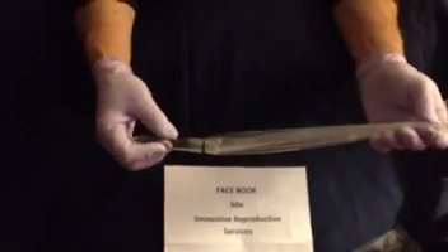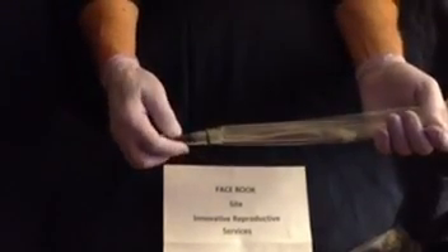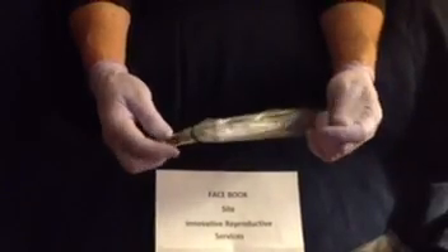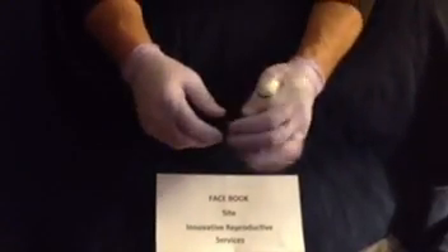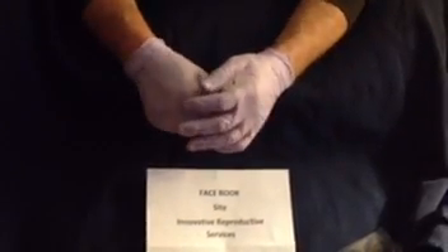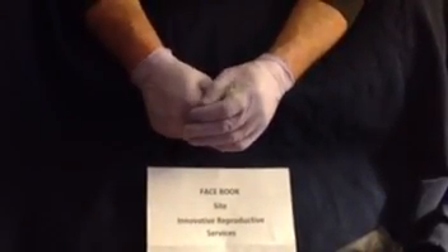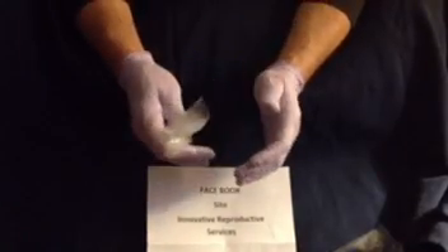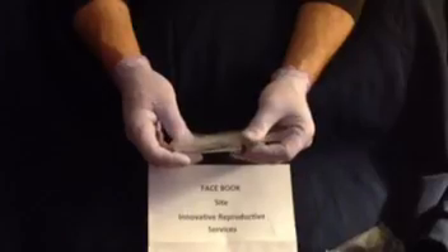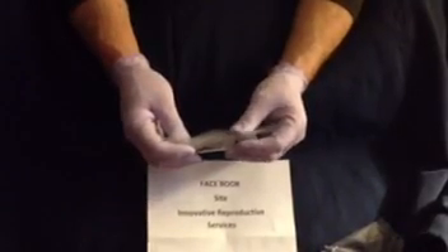Before you use this, keep in mind that every time you have semen come in contact with an article, you want to have it pre-warmed to 37 degrees centigrade, which is 98.6°F. So before you start collecting the semen, just place this inside your shirt. It'll be pre-warmed enough so that it won't have a temperature shock issue.